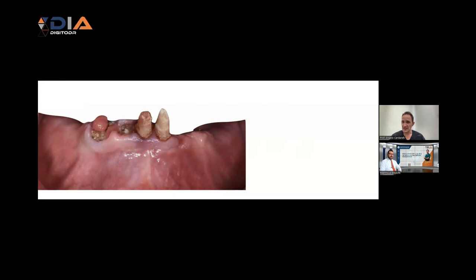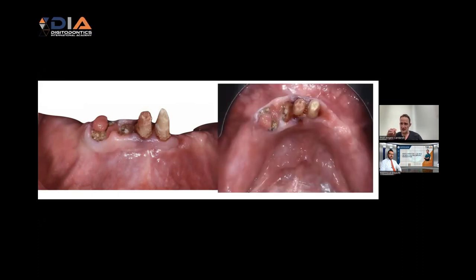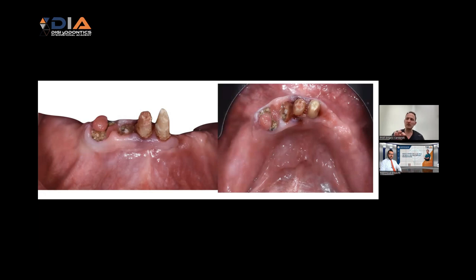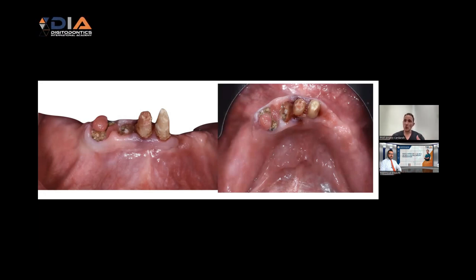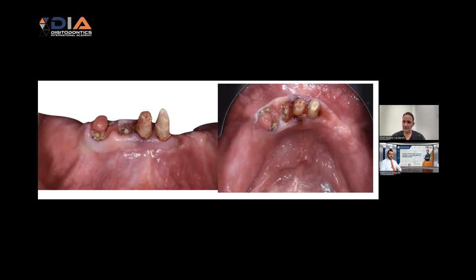We can see better the clinical situation. We have a few residual dental elements in the lower jaw that need to be removed. It's very important to observe the quality of soft tissue — there is some infection, especially on the anterior side. Infection is not a contraindication for immediate implant placement. We need to prepare the patient pharmacologically: if we have acute infection, we need to shift from acute to chronic infection using antibiotic therapy at least three days before surgery. I also always use conscious sedation with anesthesiologist support in this kind of rehabilitation.